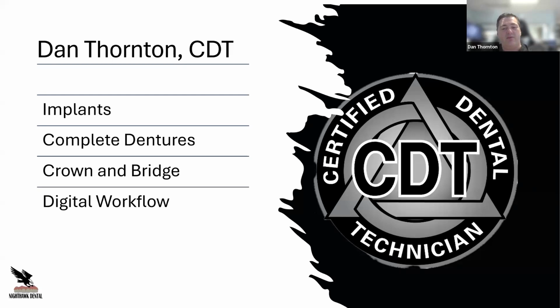And then I can leave that with the doctor if by chance that implant fails or the prosthesis needs to come out. They have a backup denture that they don't have to wait for. Now, I only do that with certain clients because some of my clients don't want that backup. They don't want to have the cost of the backup until they need it. So that kind of depends on your client too.